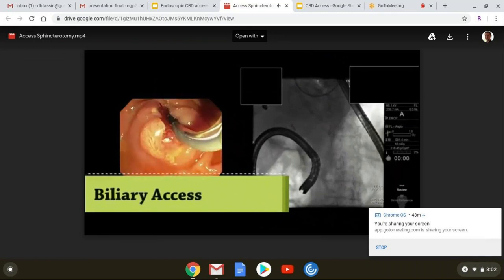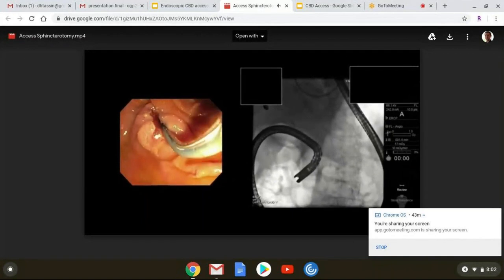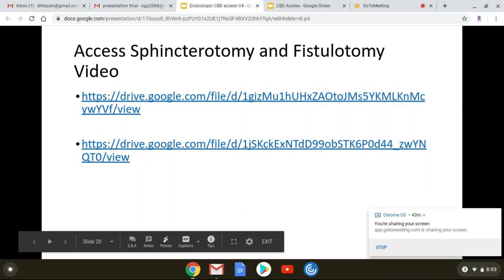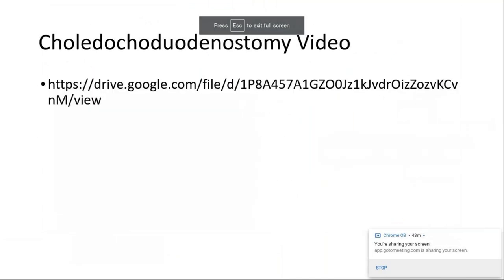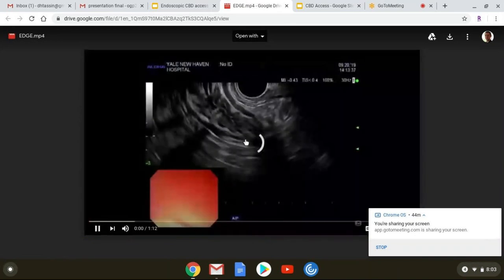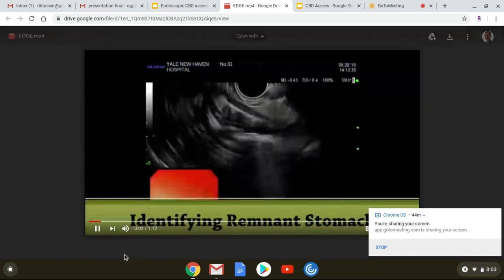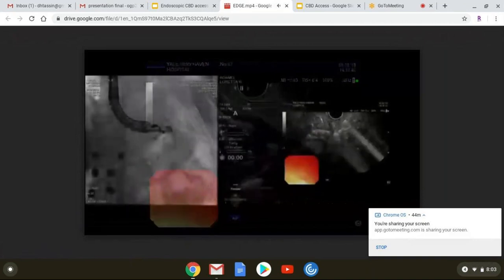Hey Jerry, that was a good talk. I just wanted to emphasize, you kind of made the point already, but pretty much all the EUS guided access techniques are mostly used when there's altered anatomy or total distortion. In fellowship, at a major tertiary referral center, we only used EUS guided techniques maybe 5 to 10 times. And if the anatomy was normal, we never had to resort to EUS because we were good at ERCP. So EUS guided access should not be used as a substitute for good ERCP technique. Just wanted to foot stomp that point.